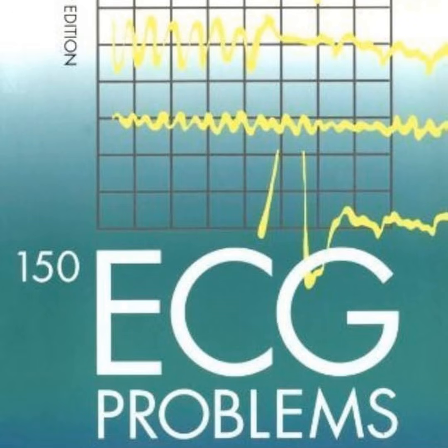Right. So say you're looking at that same tracing, but you also happen to notice prominent U waves, particularly in the precordial leads like V2. Well, those U waves are the absolute hallmark of hypokalemia, low potassium. And this is where the underlying mechanism completely dictates your management.